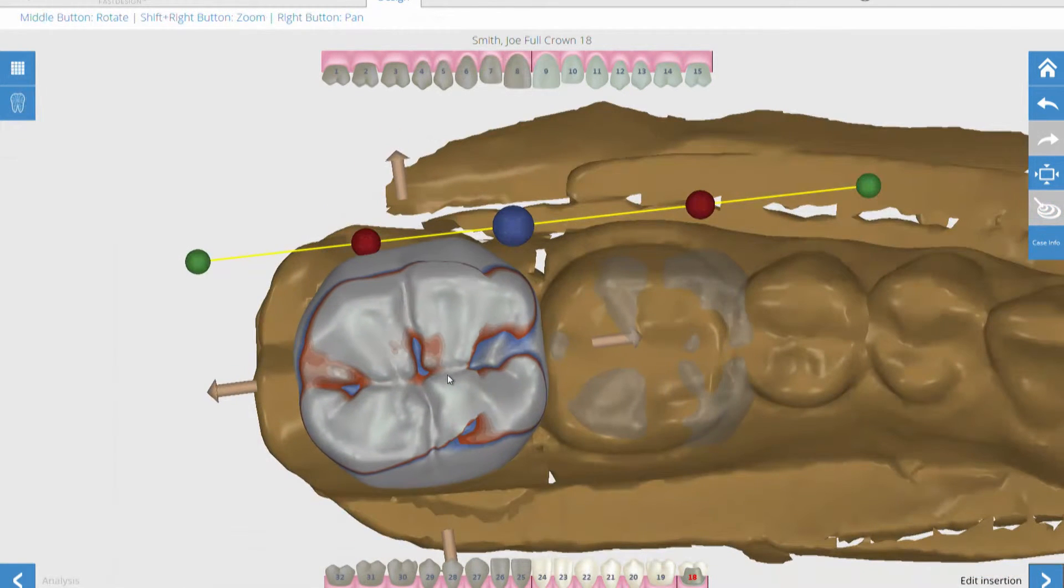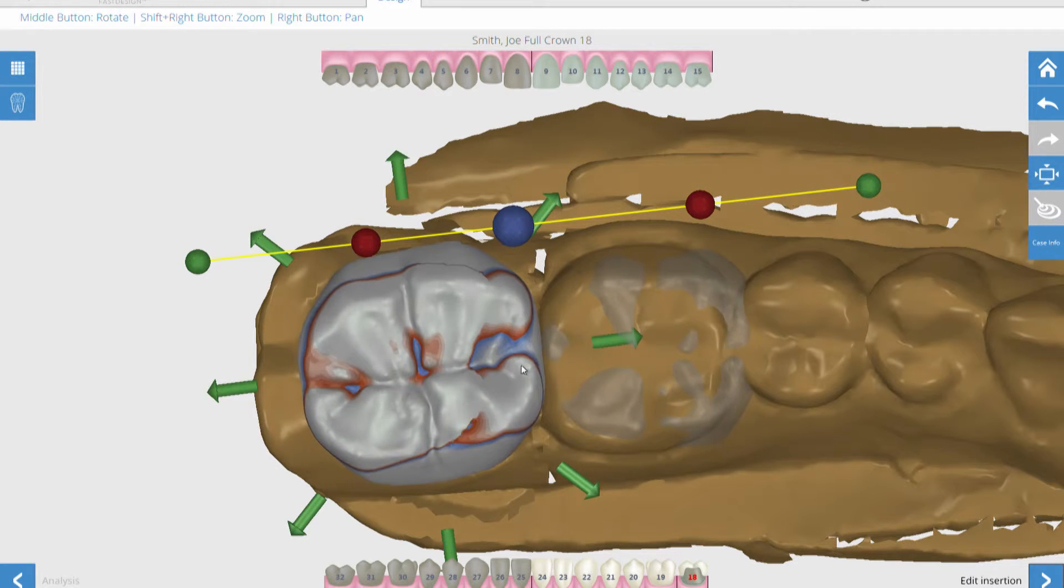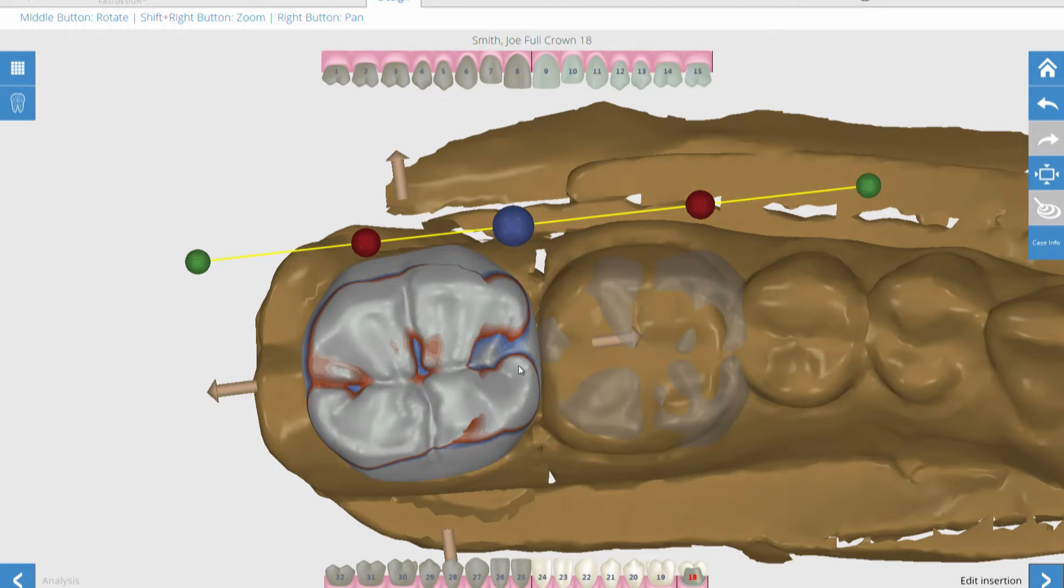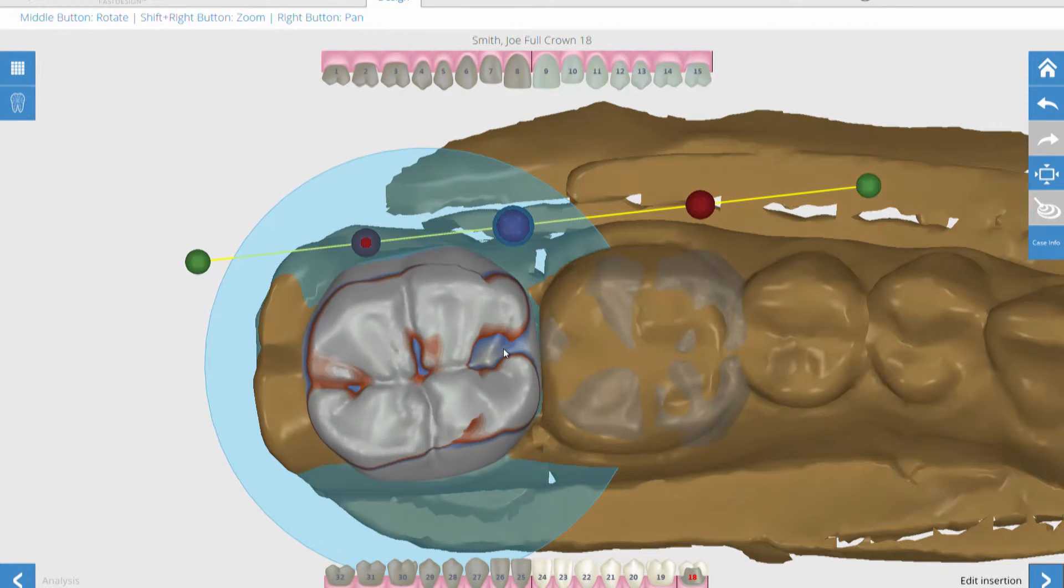After the margin has been identified, the Fast Design software proposes a crown. The rotation tool helps to quickly position the crown within the arch form.